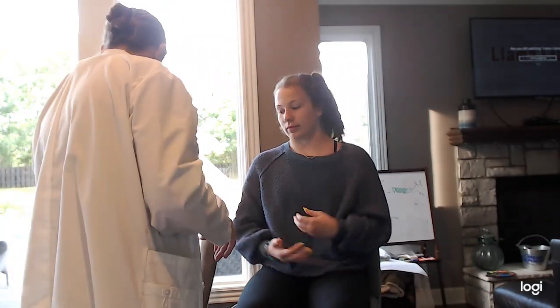Next, we'll move on to the inner eye, and we're going to use the ophthalmoscope for this. This will be part of the fundoscopic exam. I'm going to use my right eye to her right eye as I demonstrate this. I've got my settings on 0. I'm going to put my hand up here on your forehead, put this up by my eye. I come in at an angle.